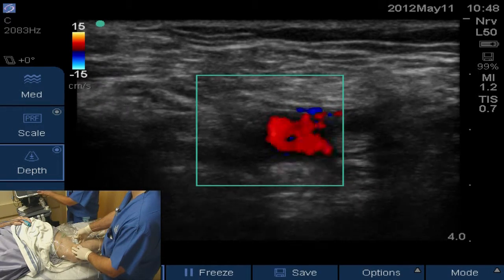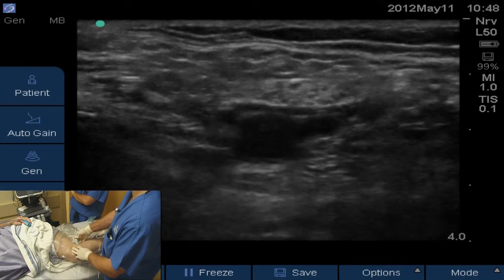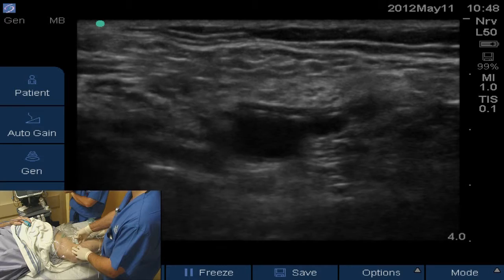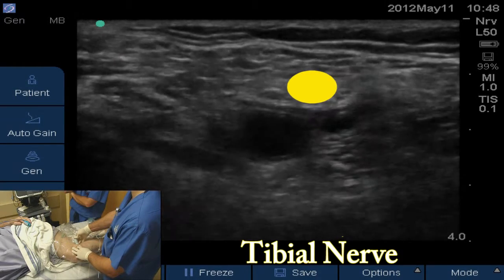I'm going to go back to 2D. You never want to leave the color flow on while you're live scanning because it degrades the image a little bit. Superficial to that artery, which is up on the screen and a little to the right — which is technically medial — is going to be the tibial nerve. All we're going to do is find that tibial nerve there; it's kind of a honeycomb-looking structure.